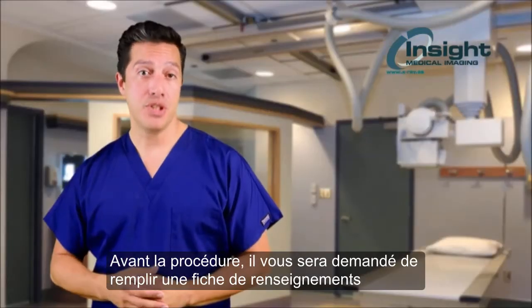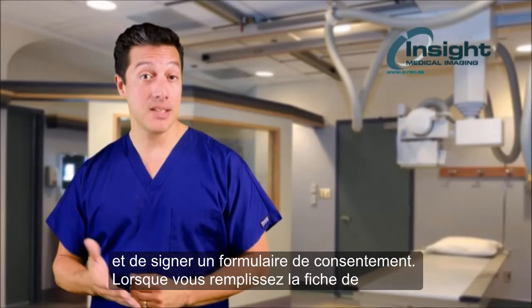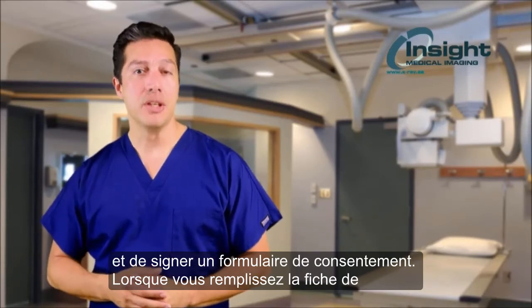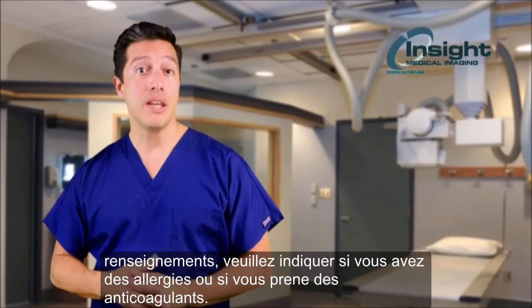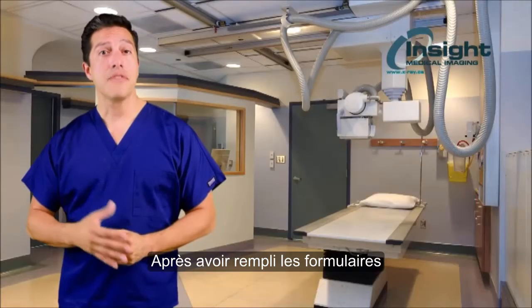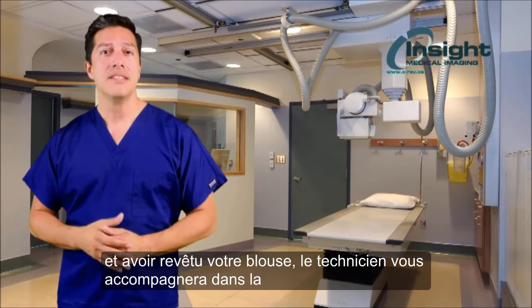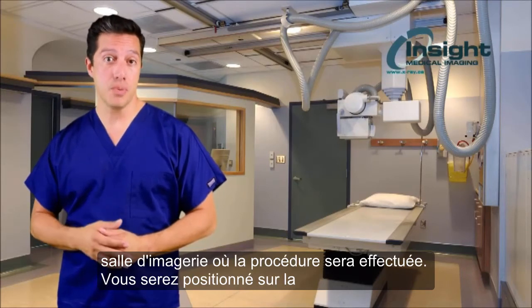Before the procedure starts, you will be asked to fill out an information sheet and sign a consent form. When filling out the information sheet, please indicate if you have any allergies or are taking any blood thinners. After filling out the forms and changing into a gown, the technologist will then take you into the imaging room where the procedure is performed.